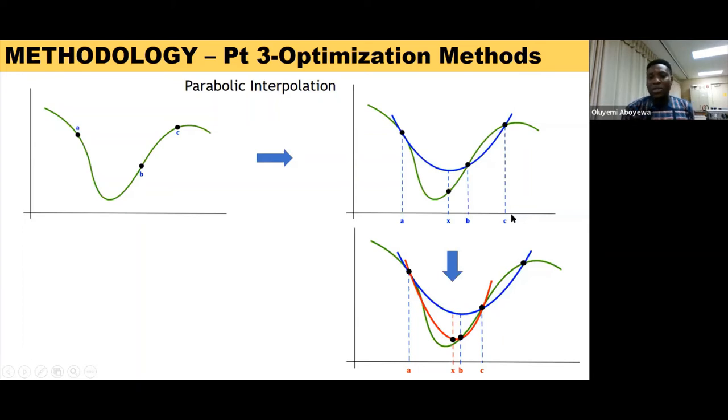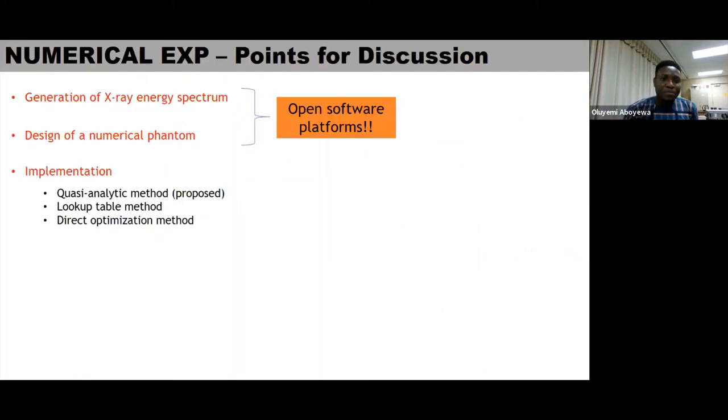This is the concept that was used to calculate the Y piece, which is the photoelectric effect component in that projection decomposition. Moving on to how the author implemented this, he used open software to generate the energy spectrum.